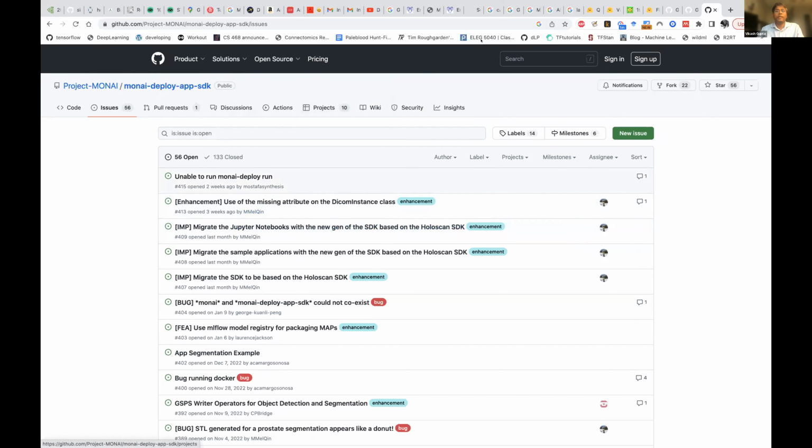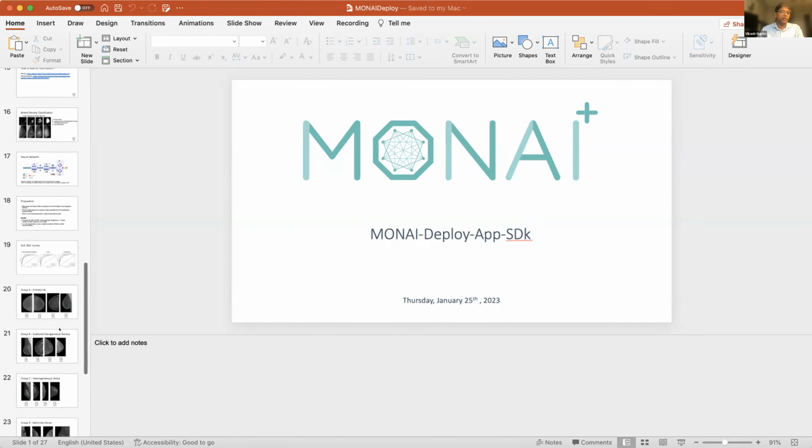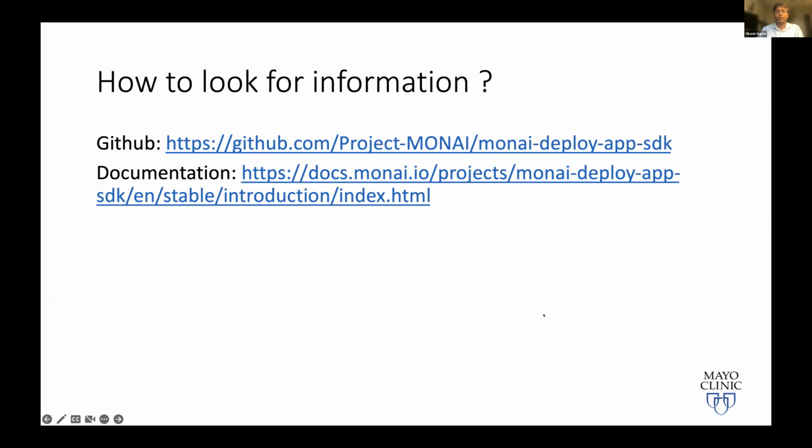Let me just stop sharing, and share again. So this is all about how to look for information and write your own MONAI application packages. Does anyone have any questions, or do we have time for a demo?